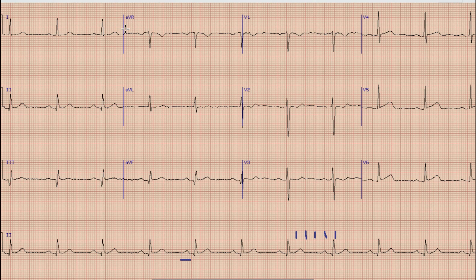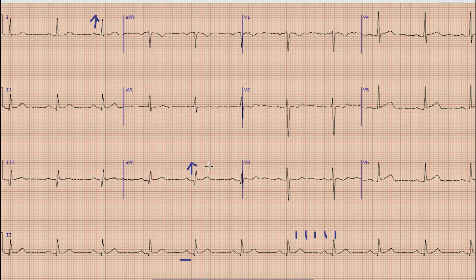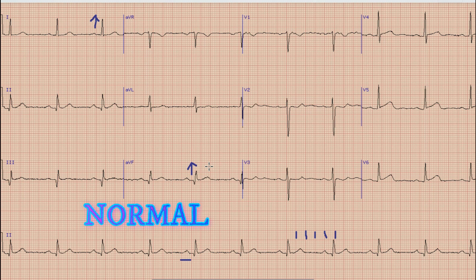The next step is finding the axis on ECG. We look at lead 1 and lead aVF. As we can see, the direction of QRS complex in lead 1 is upwards, and similarly the QRS complex in lead aVF is also directed upwards. So by applying the rule of thumb, the axis in this case is normal axis.